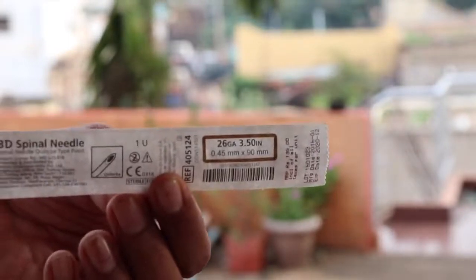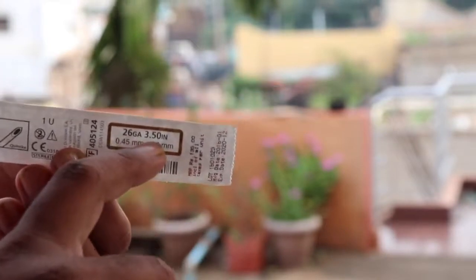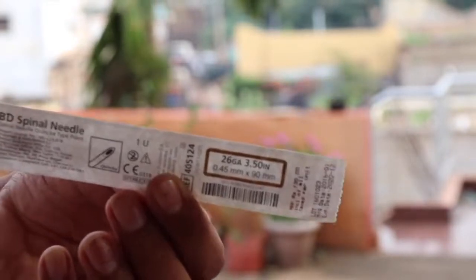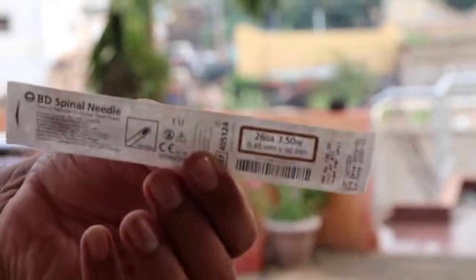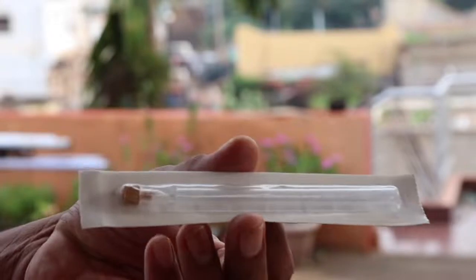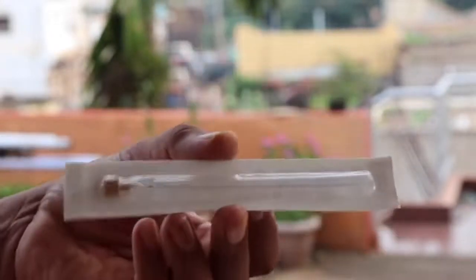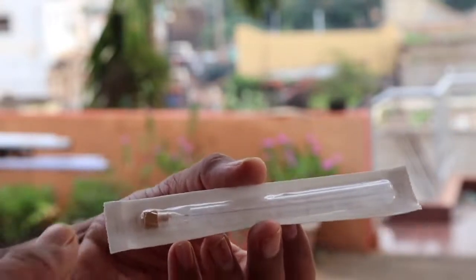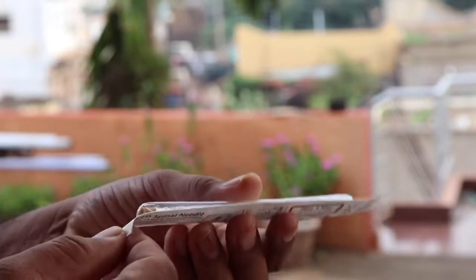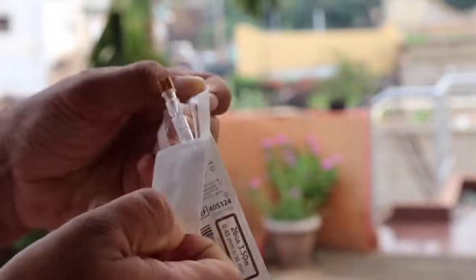This is a spinal needle in sterile condition, 26 gauge or 3.5 inch. It comes in sterile format and the needle is protected with a plastic sheath. Because the 26-gauge needle is one of the thinner needles, there is more chance of bending, so it is protected with the plastic sheath. We can peel the wrapper and open the needle.